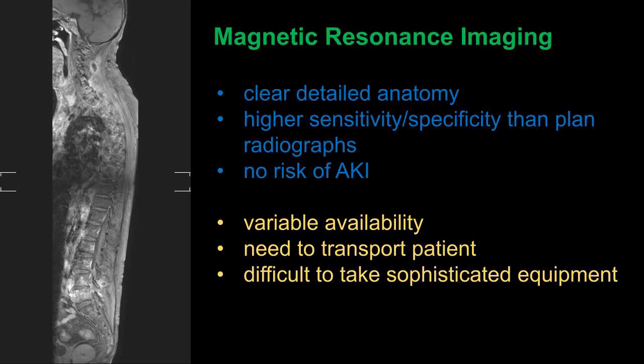patient. But here is an image of the spine, and MRI is extremely good at picking up things like discitis or epidural abscesses, which this man has.